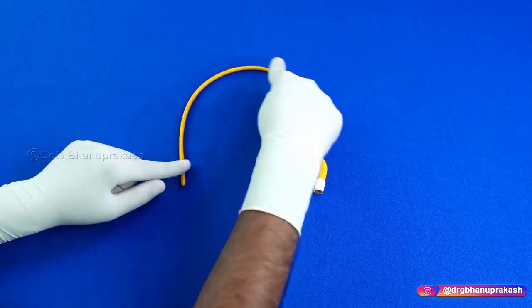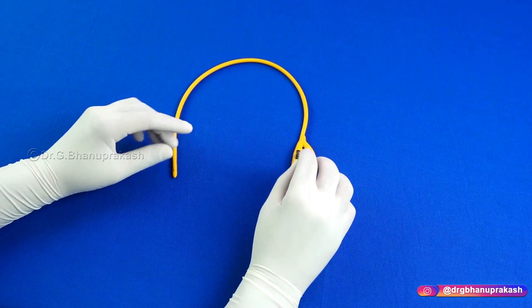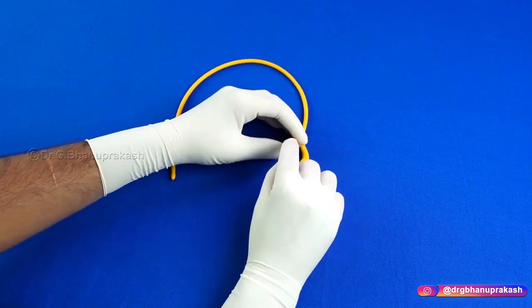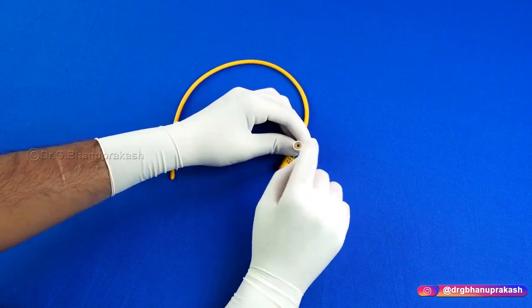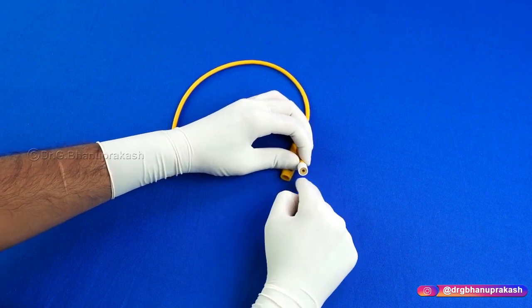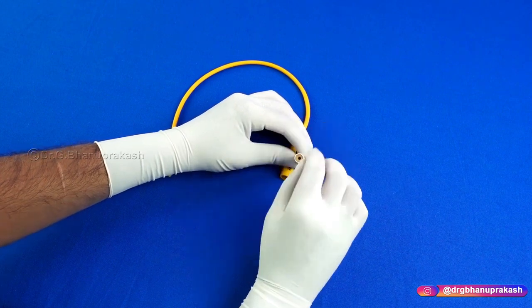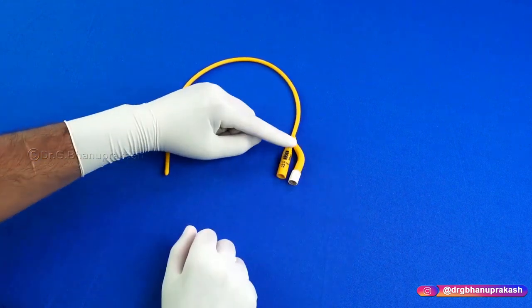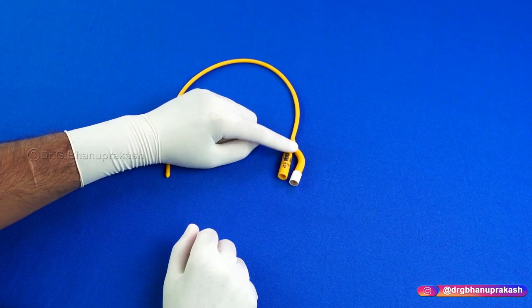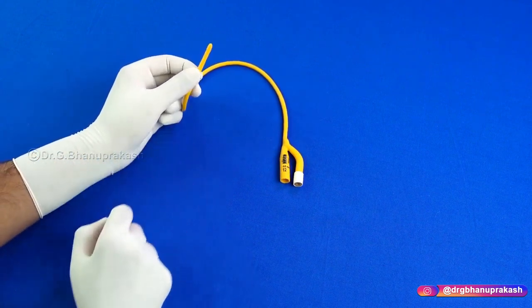As you can see, this entire thing is called a Foley's catheter. Within this Foley's catheter, you have different parts. This opening which you see is called the urine drainage port. Next, this part which is surrounded by the white bulb is called the balloon port. I'll be explaining why it is called a balloon port. Second, this region which you can see here is called the Y junction of the Foley's catheter. And all along this is called the tip of the Foley's catheter.